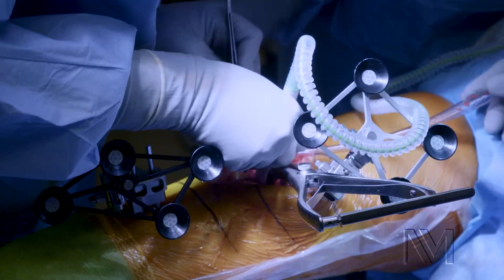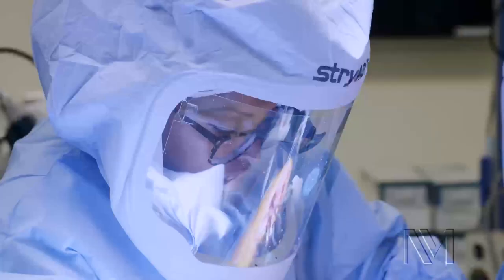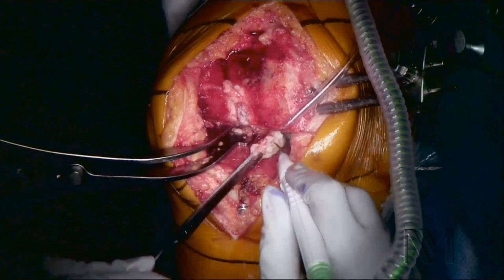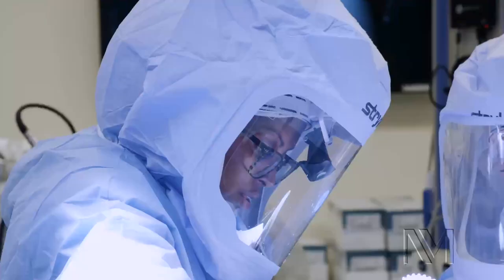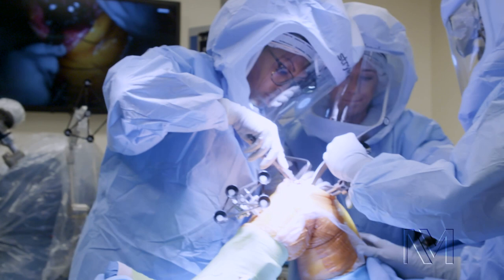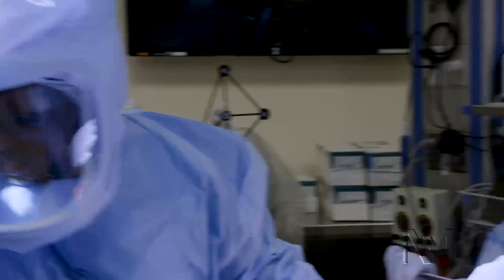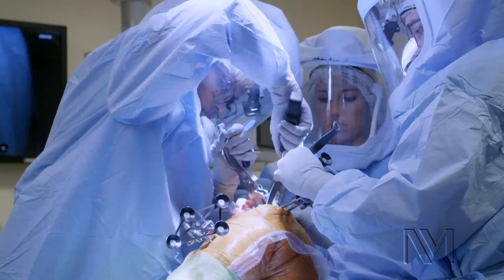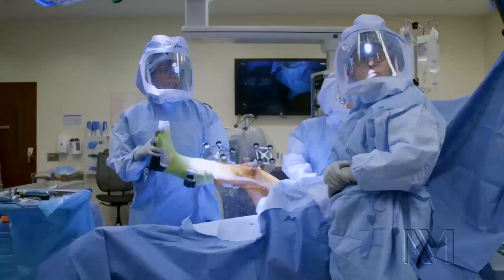The next step, once we clear out all the tissue, is we put in our trial components. Before we use the real thing, we want to make sure this is the right fit for the patient. This is a trial femur component. We're now just putting it through range of motion here, and we see it's moving well. We've got her back to full extension.